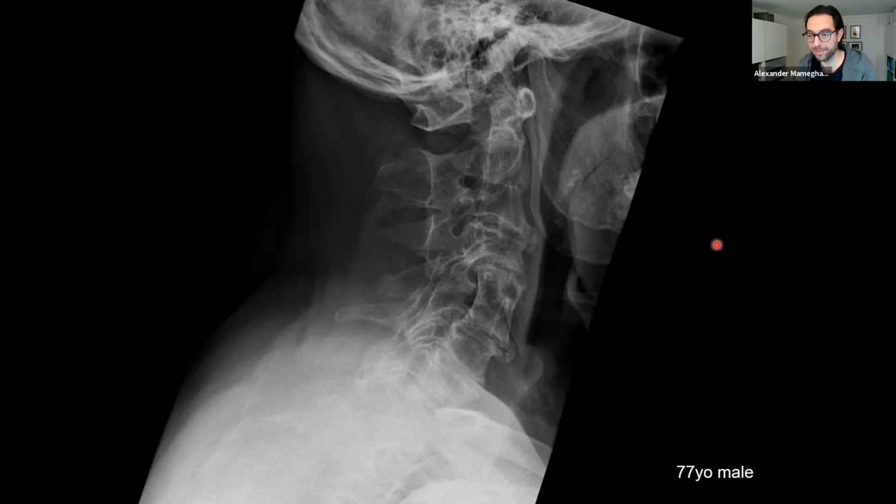Yeah, thank you. To add to what Nader just said, in the posterior elements I think you have some additional fusions. You probably have everything fused here, not just across the disc spaces, but across the posterior elements and the skull base as well.